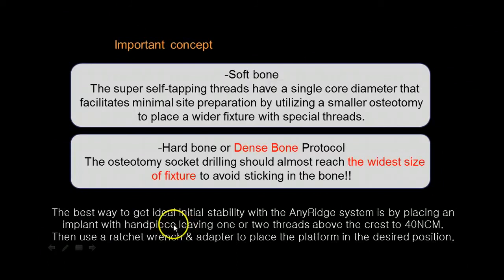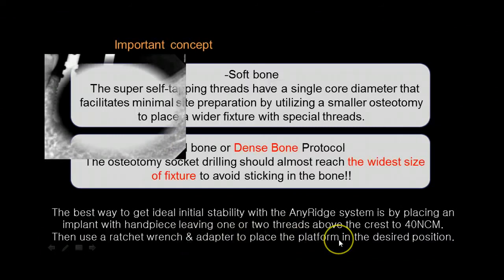And you want to use a handpiece with plenty of torque, leaving 1 or 2 threads above the crest at 40 Newton centimeters. Okay? Then use a ratchet adapter to place the implant to the desired position. Now, what does that mean?